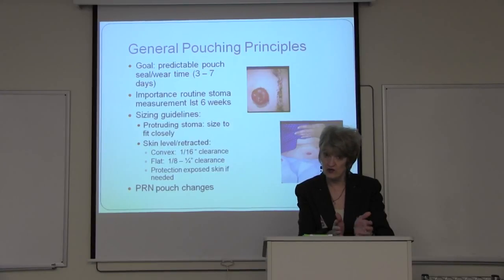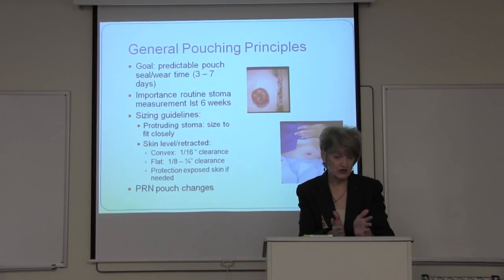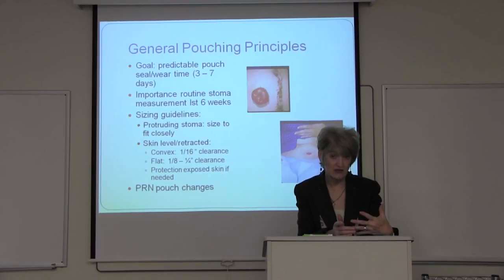This is Friday. We just put a pouch on. So based on what happened in the hospital, you would change your pouch on Sunday. Now, on Sunday, if you check your pouch seal and it seems to be very intact, there's no evidence of leakage, there's no itching, there's no burning, the barrier on your pouch doesn't feel abnormally soft, then you can extend your wear time by 1 day and you can change your pouch on Monday instead.